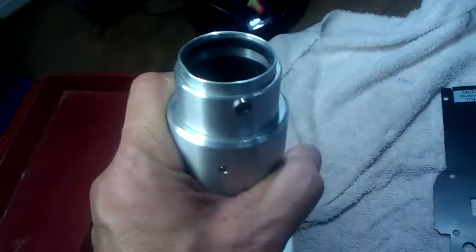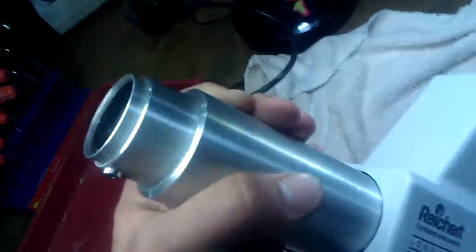Some of the screws were loose, but not too bad. The transformer is okay, doing alright. We cleaned up all the connections, cleaned the tube, and cleaned the optics.